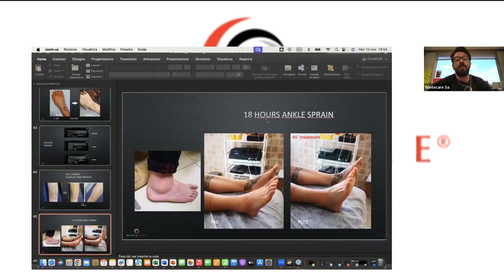So if I am on the thoracolumbar fascia, I can cross my hands with the electrode in my hand on the sacrum first, and then on the diaphragm secondly, and push, create space. Then I would go on the gluteus in order to release in case there's some tension over there. And normally there's tension over there. Increasing the temperature, releasing the tissue, manipulating with my fingers. I can use my thumb underneath the electrode and push so that I can release the muscle quicker.